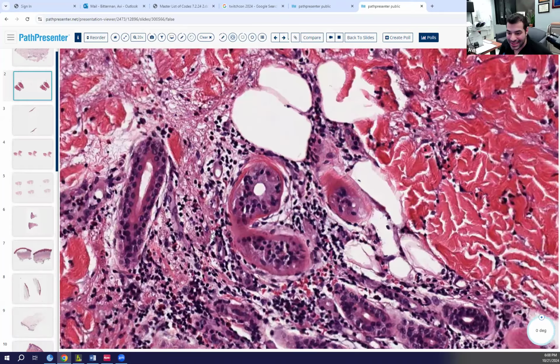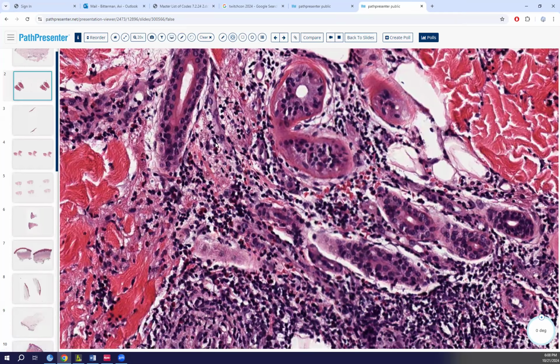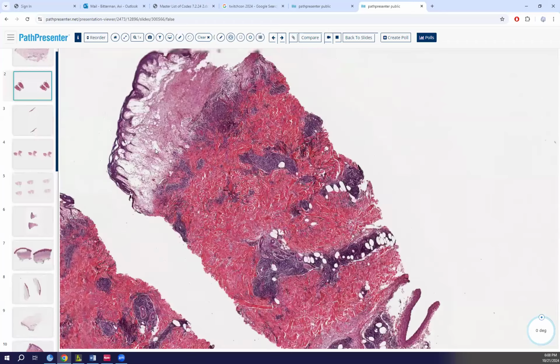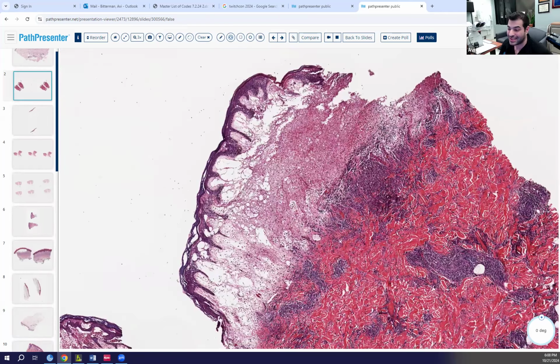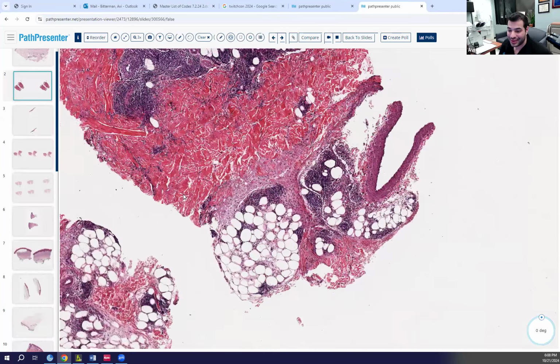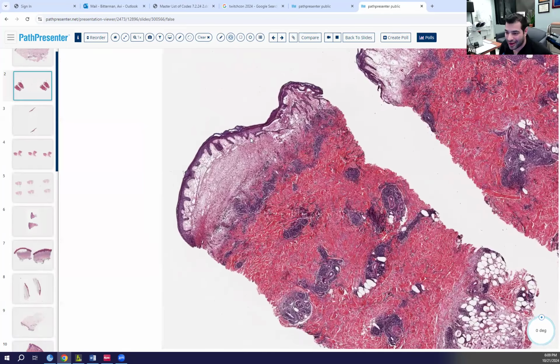See if there's a little more edematous area where it could be easier to see. Do you see them now? Yeah. Here's EOs, with a great deal with the subepidermal split. We're thinking that this is bullous arthropod, and the fact that there's also a deep infiltrate. It's so edematous, it basically created a split. It's a very deep infiltrate loaded with EOs. What's number one on your differential? Bullous arthropod, right? So yes, this is your exuberant bullous arthropod reaction.